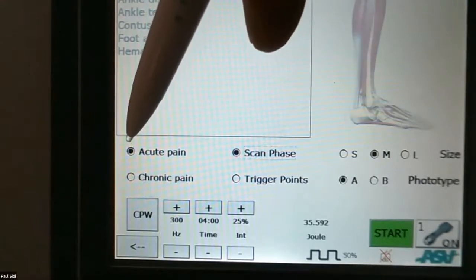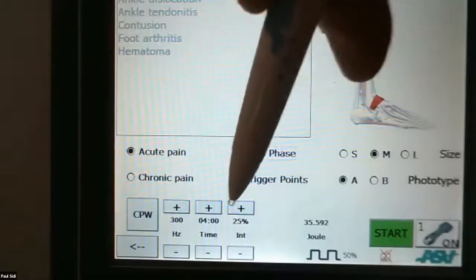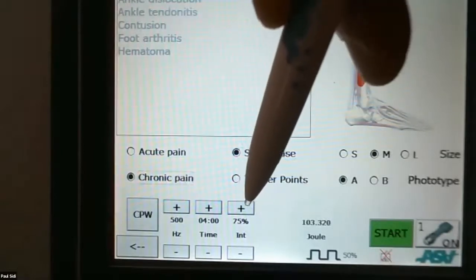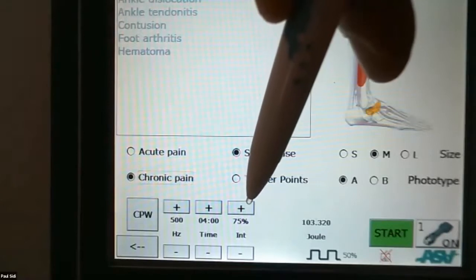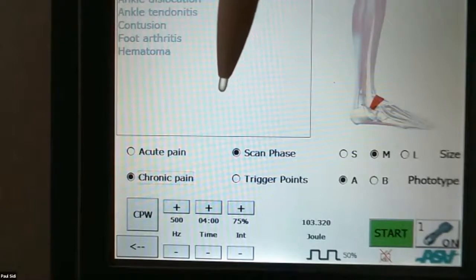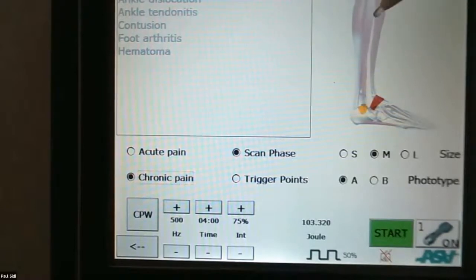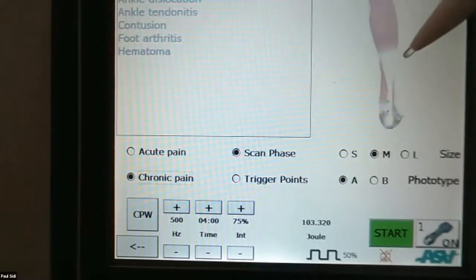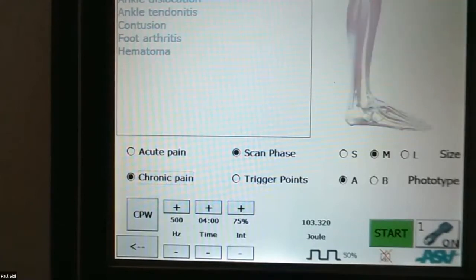It's not acute. You can see 300 hertz, 25%. We go to chronic, goes up, sorry, 500 hertz, 75%. We can even go up a little bit more because it is a pretty chronic problem, this. And what we're going to do is we're going to scan really largely on the whole base of the foot, on the plantar aspect, and probably not on the talocrural joint, but really in the gastrocs. Loosen up everything down the Achilles and get that all going there.